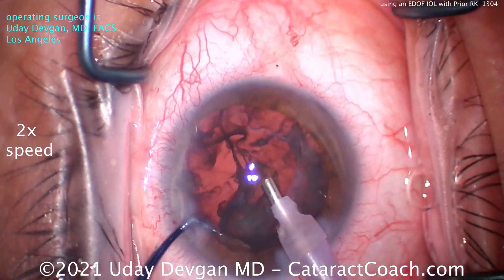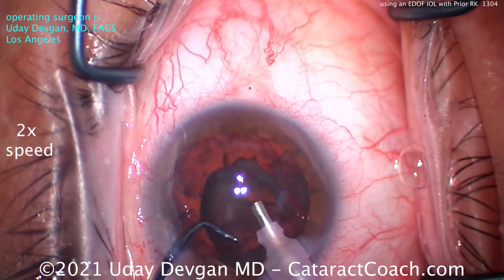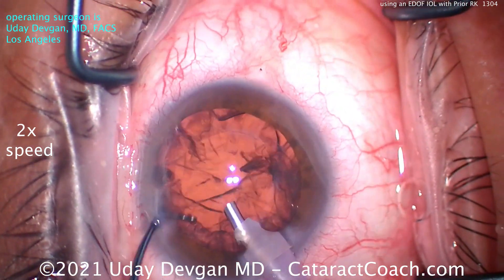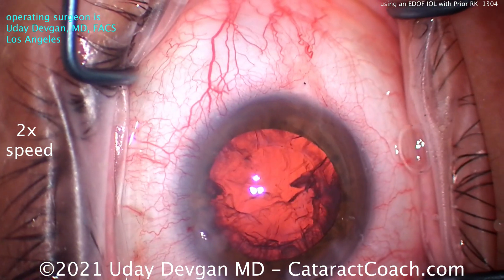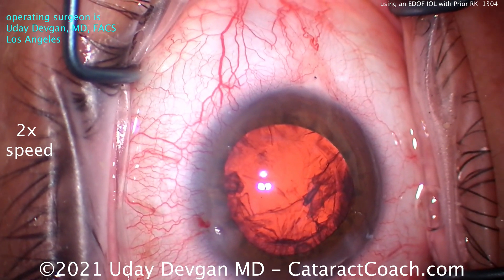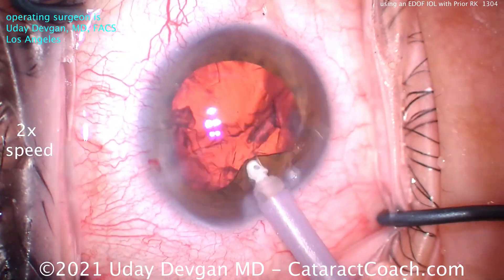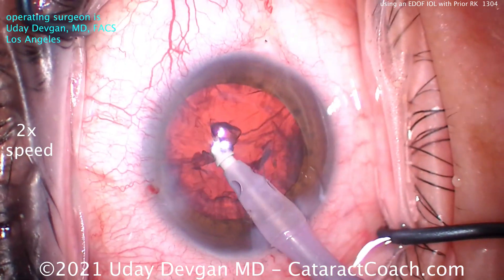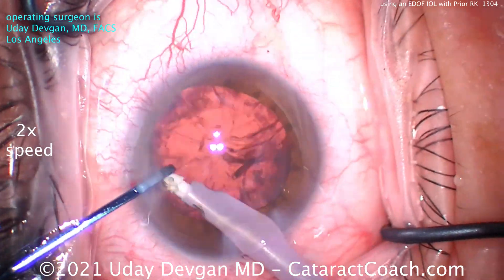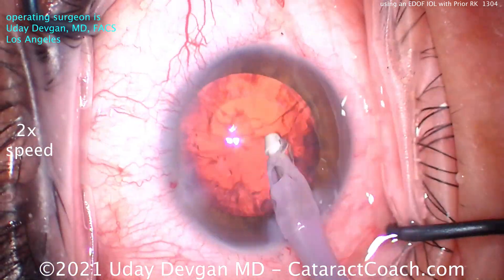So we don't want that. We've done the various calculations — all detailed on CataractCoach.com, which has a whole subsection on radial keratotomy explaining the lens calculations. We chose the appropriate lens power and the toricity, aiming to give this patient a post-op refractive goal of about plano.